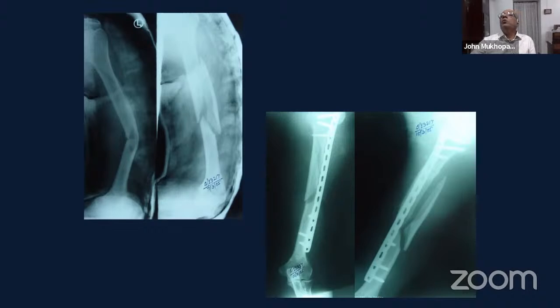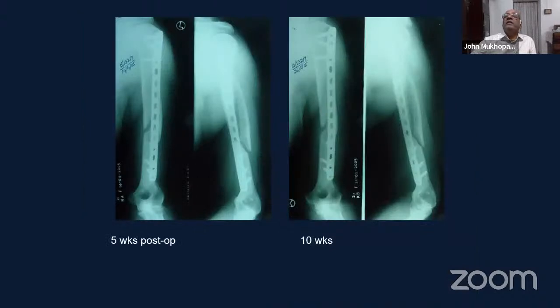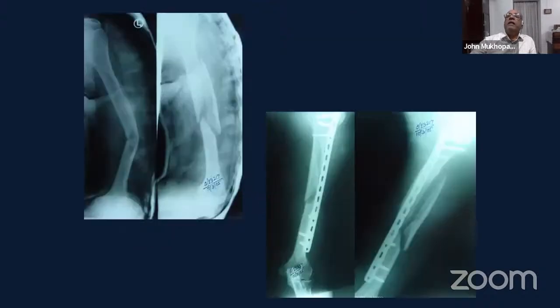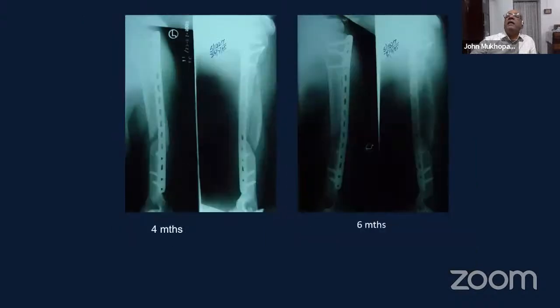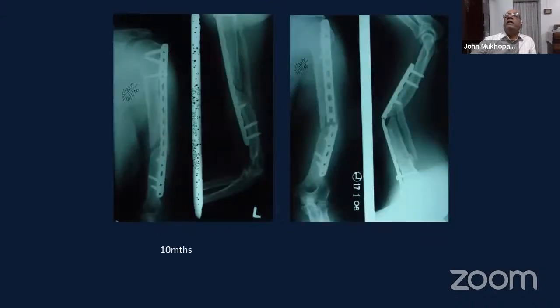This was in 2005. And you can see over a period of time that fragment has remained apart. And you can see over time there's been a little bit of distraction also at the immediate fracture site. And over time, this fracture has failed to unite. And then eventually the plate broke after 10 months.